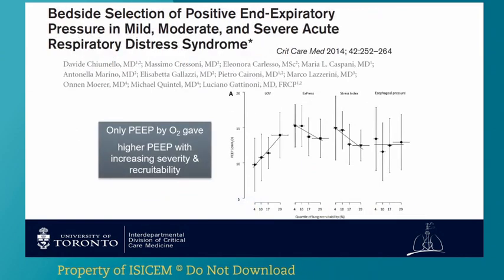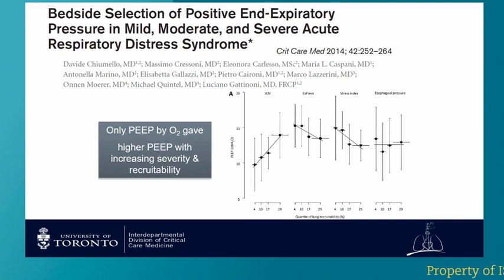And if you want to use a physiological argument to this, interesting to note that using data from that same Gattinoni CT study I showed you before, it was only the PEEP FiO2 table approach that actually led to giving higher PEEP to patients who are more recruitable, in contrast to using esophageal pressure or stress index in this example.